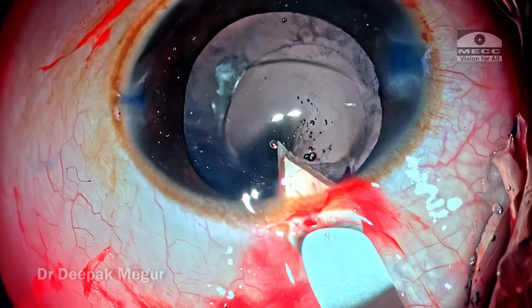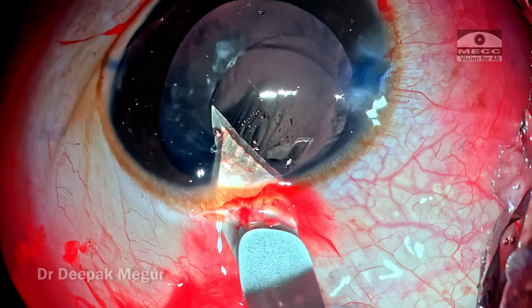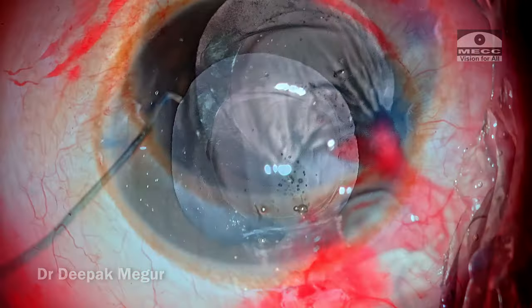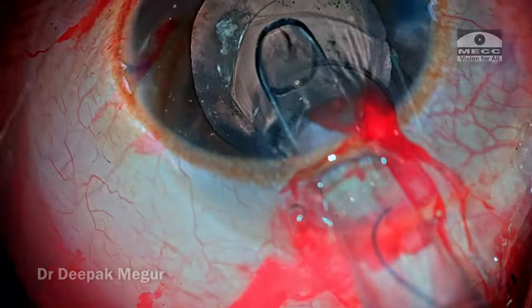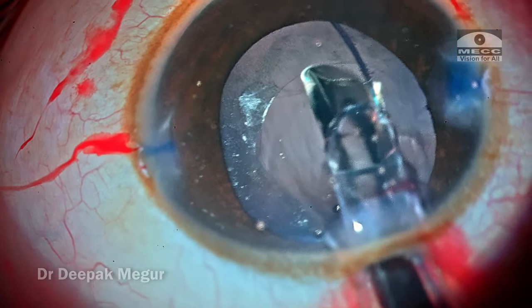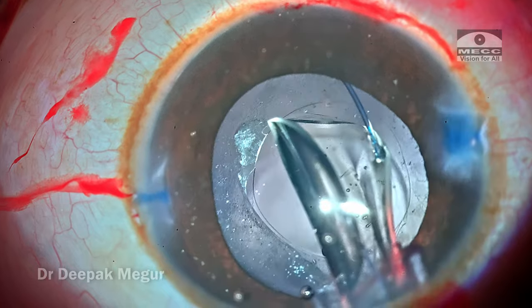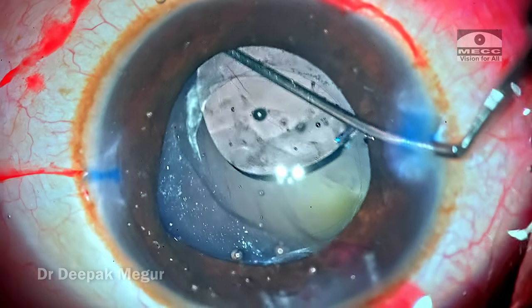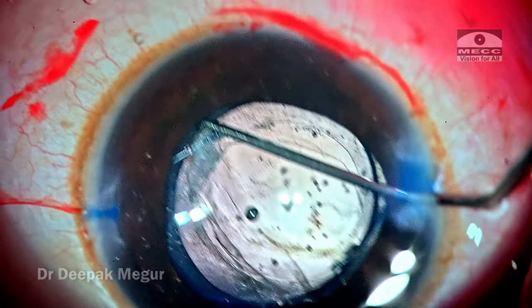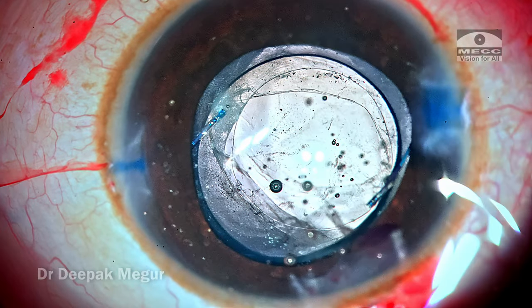In a post-vitrectomy eye, especially in a child with very low scleral rigidity, negotiating the cartridge through a tight incision becomes very difficult. Enlarging the incision slightly allows the cartridge to slide in easily. Because we have maintained space with sodium hyaluronate, the haptic can very easily be negotiated over the anterior capsule, and then the trailing haptic is dialed into the sulcus. The lens is now sitting nicely in the sulcus.